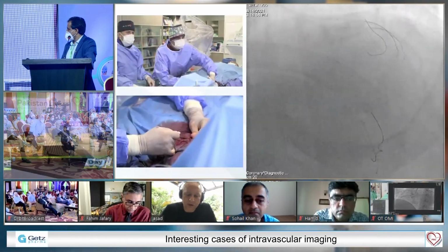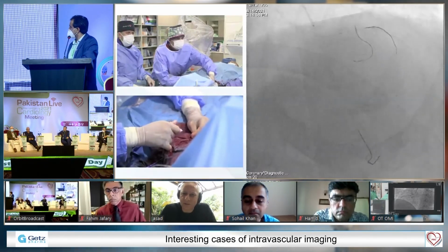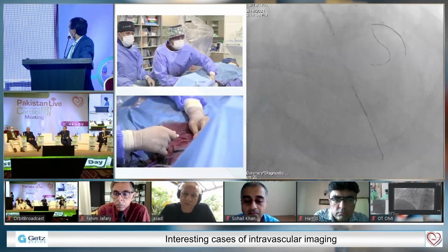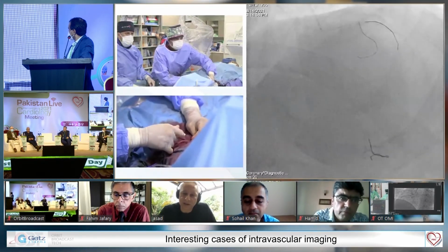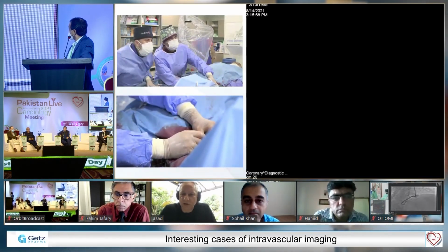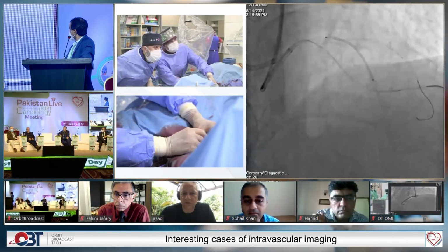The softest one available is the SUOH 03 from Asahi. I think it's like a 0.3 gram tip, but the body is really soft. You also want a low profile, flexible microcatheter, maybe something like either a Caravelle or a Turnpike LP for epicardial collaterals. For septal collaterals, different operators have their different preferences. You can use any.